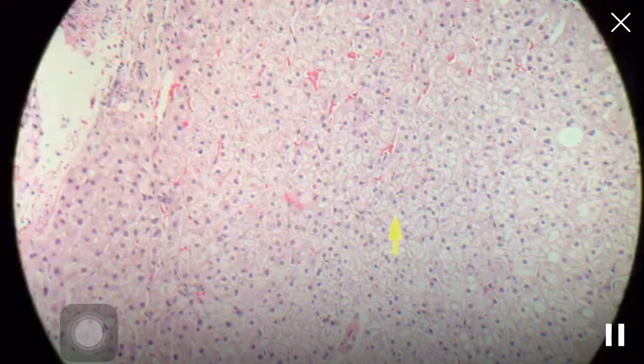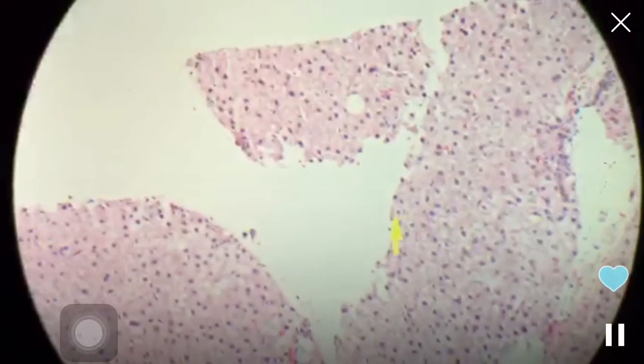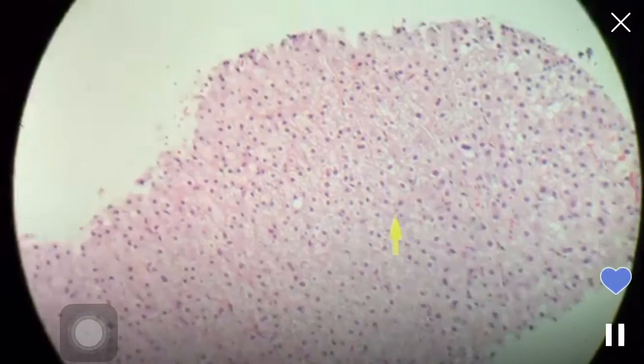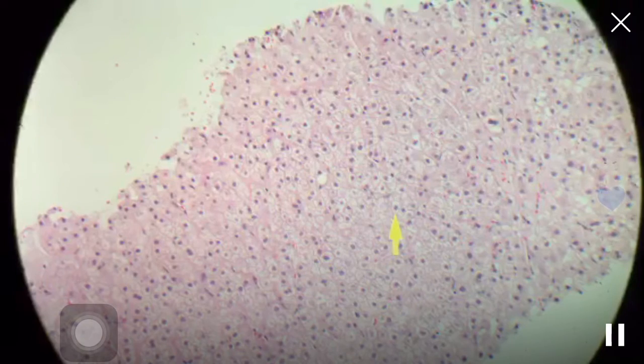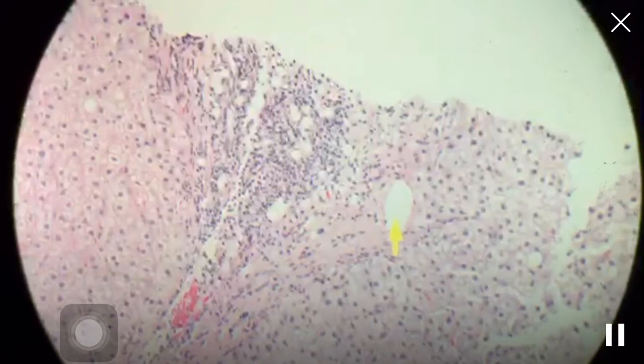It's more typical in alcohol to see neutrophil-rich infiltrates than it is in non-alcoholic fatty liver disease, but you can see it in both. So when you see lymphocytes in a lobule, like in a case of steatosis, you do not call it a component of steatohepatitis, right? Well, it's not really clear. We're sort of in a transition zone. So, for example, I blew by this portal tract.